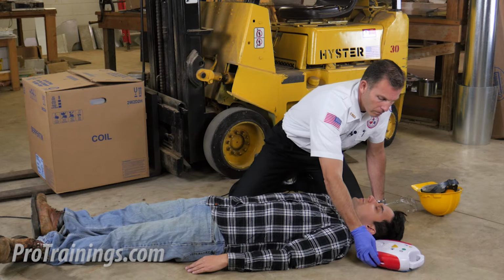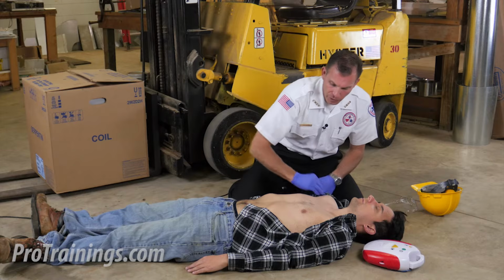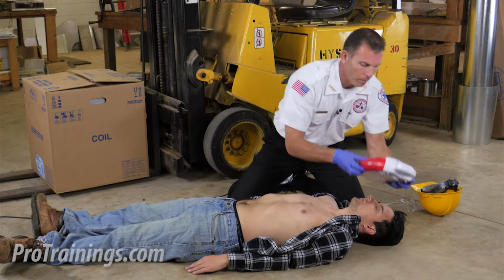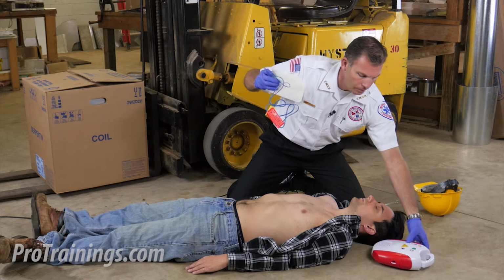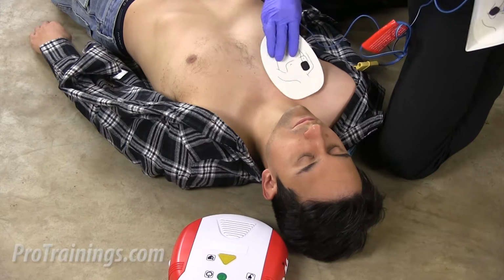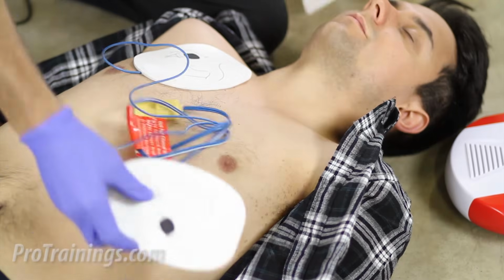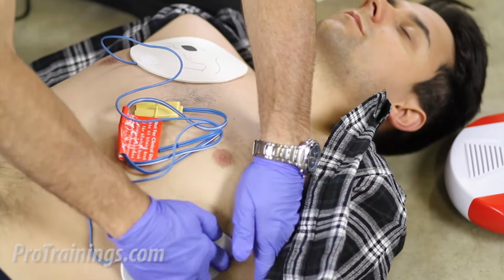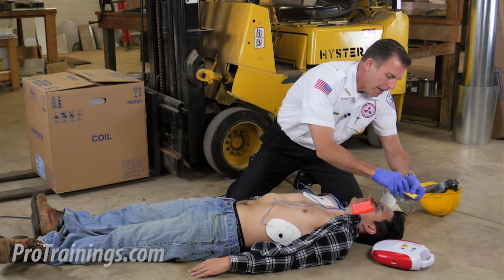Remove clothing from person's chest. I'm going to remove the clothing and dry off the skin where I need to put the pads. Attach pads firmly to person's chest as shown. I pull out the adult pads and I place the pads correctly: one above the right breast, one on the left mid-axillary, below the left breast. And now I plug in the pad connector.